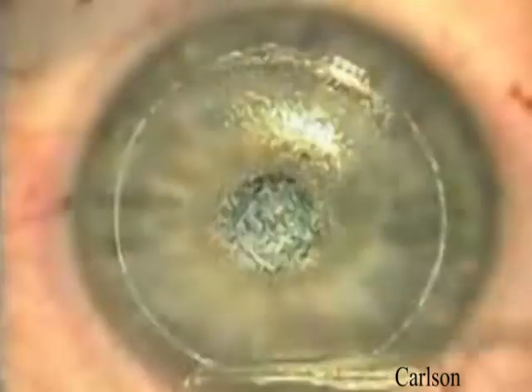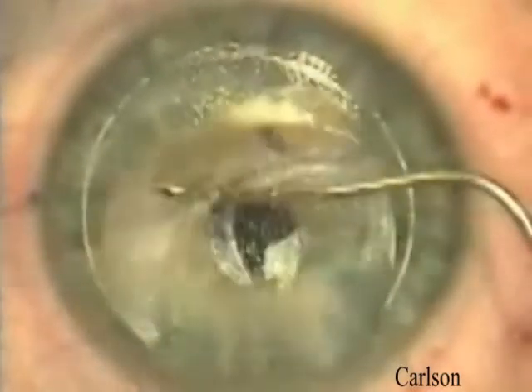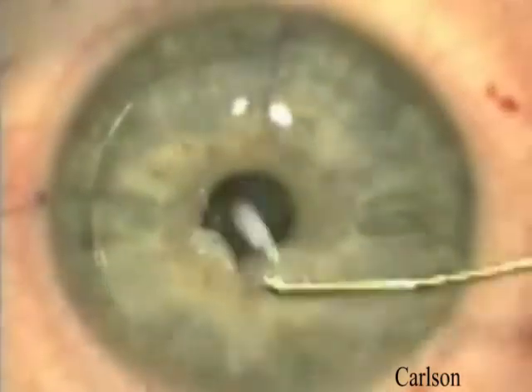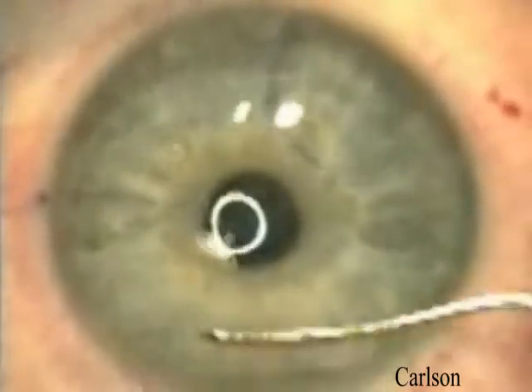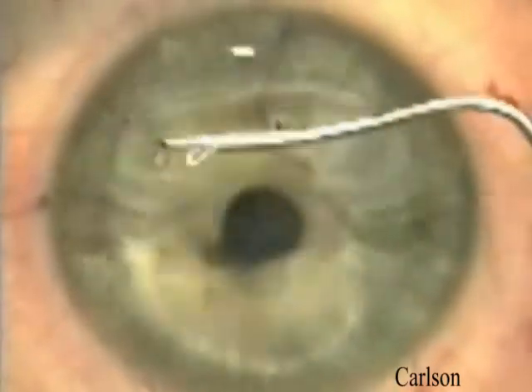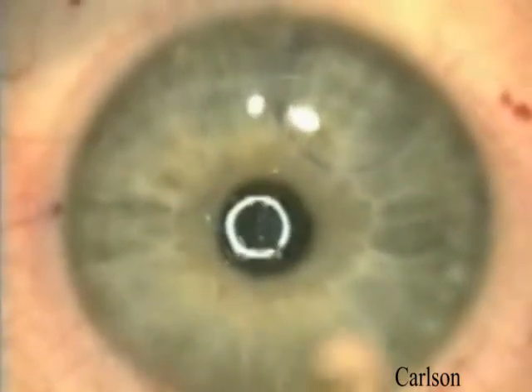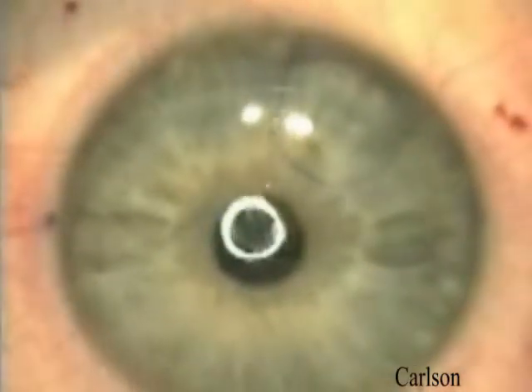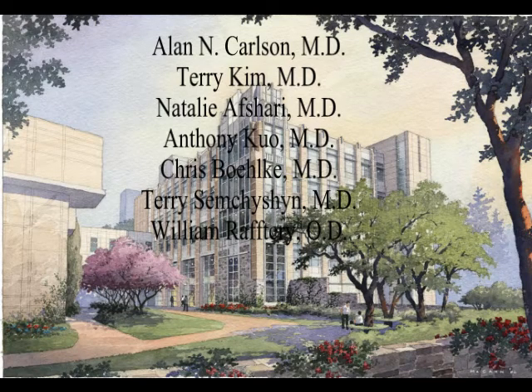Again, the patient's not feeling anything at this point, and they were only seeing the flashing light, the fixation light, as the laser itself is a wavelength that is outside of what we call the visible spectrum. The flap adheres within 2 to 3 minutes, making this a 19-minute procedure for both eyes. We examine every patient prior to leaving the Duke Center for Vision Correction.